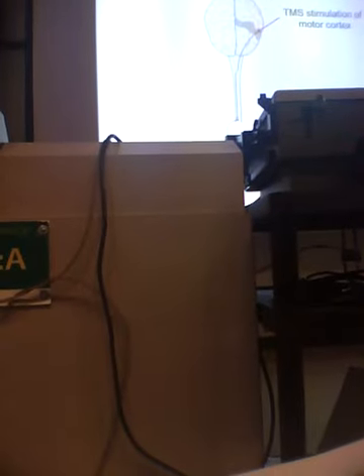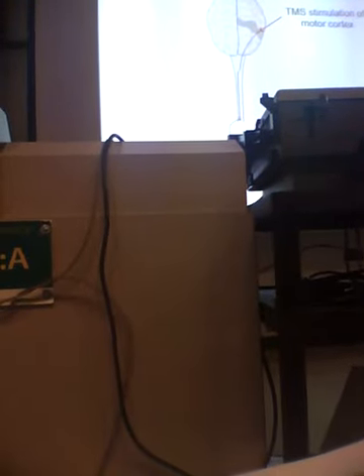And if you give TMS on the cortex, then you can activate the descending fibers from the motor cortex that go down, let's say, the hand muscle. And so what you can do is put EMG recording electrodes on the hand muscle, and you can put the magnetic pulses on the skull, or through the skull, and you send in the pulses, and what you'll see is you might see the hand twitch like this. Every time you give a pulse, the hand will twitch.